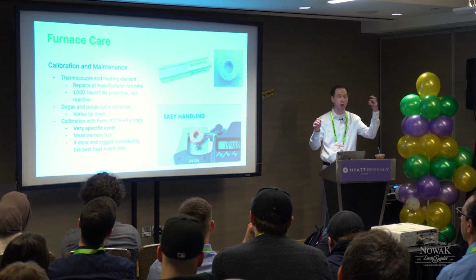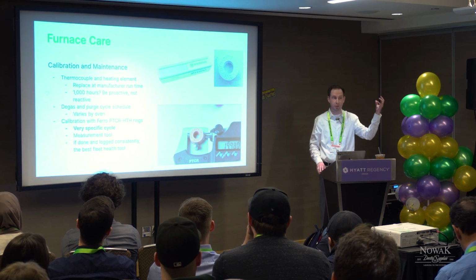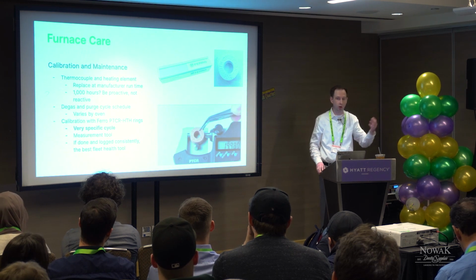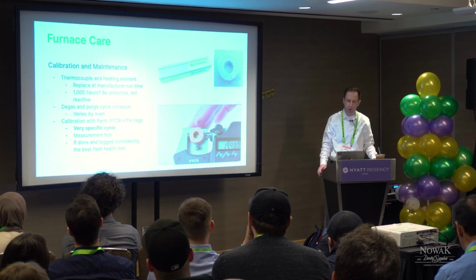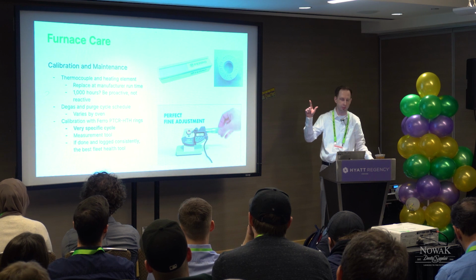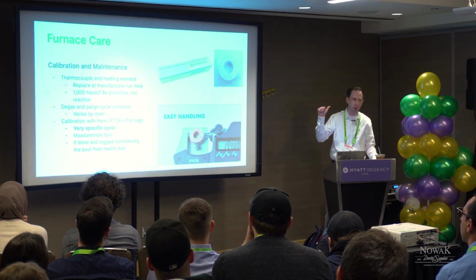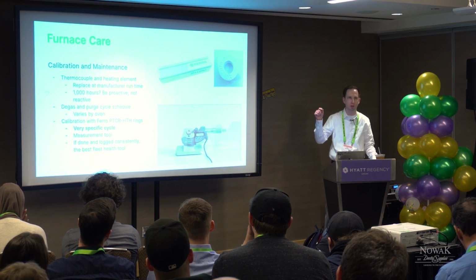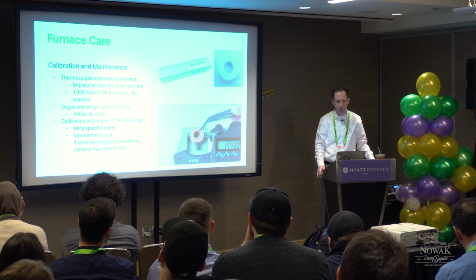And if you're not tracking what units are coming off of what furnace, like if that isn't clearly managed and tracked in the process, you're going to be guessing what is going on, right? So be proactive and not reactive with thermocouples and heating elements. For those that don't know, thermocouples are pretty much a fancy thermometer in your furnace. The heating elements, there's going to be 2, 3, sometimes 4 or 5. They're the elements that heat, right?